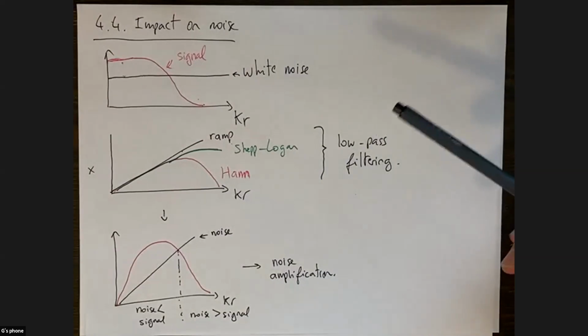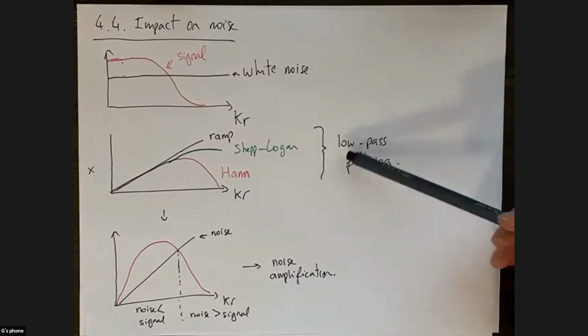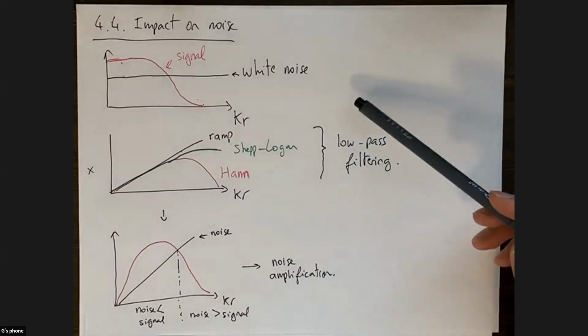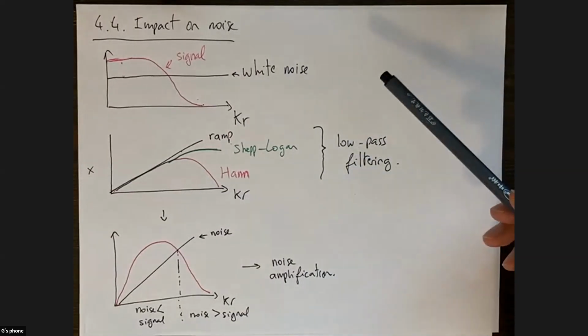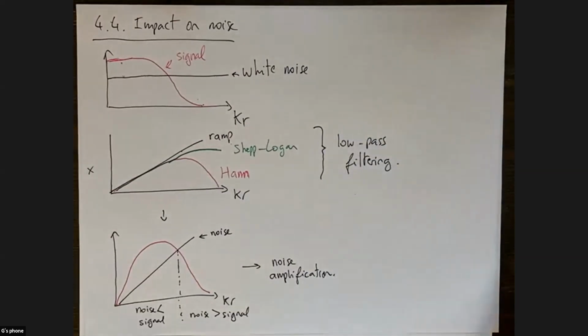Basically, next lecture, I will start by showing images and examples of this. I think today we don't have time, but on Monday, I'll definitely show you some examples of filtered back projection for different types of objects. And we'll see the sinogram, and we'll look at reconstruction using different methods.